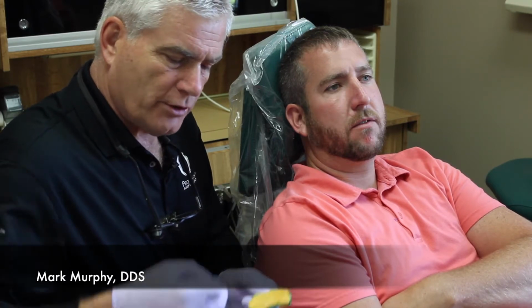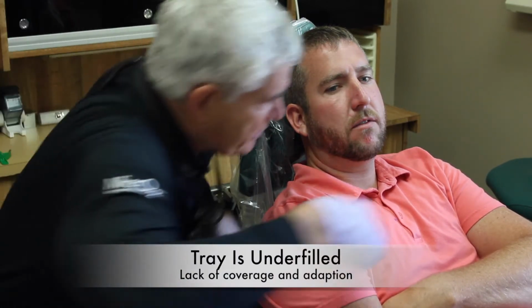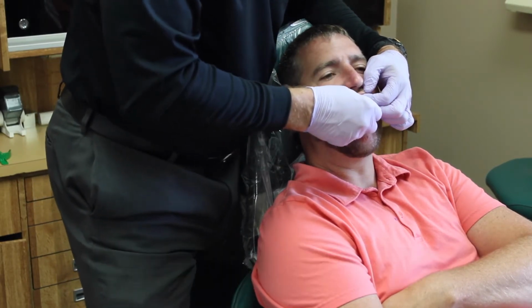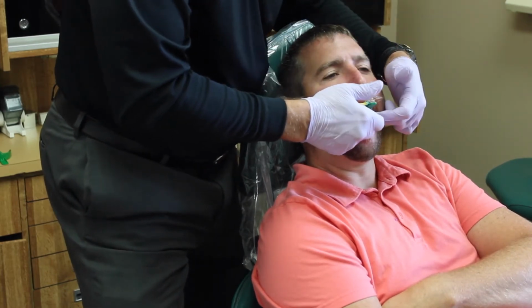There are so many considerations when we're taking an impression. Here I've actually got a tray that's a little bit underfilled, so when I cover it with the saran wrap and place it into the patient's mouth, although I'm going to get an impression, I'm probably not going to get good adaptation and good areas covered all the way around, and that can be a challenge.